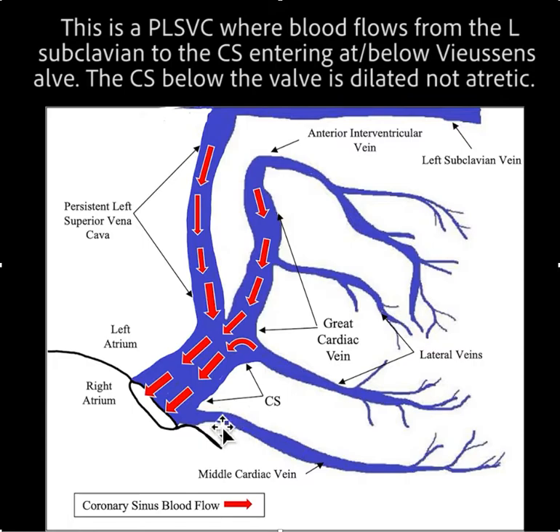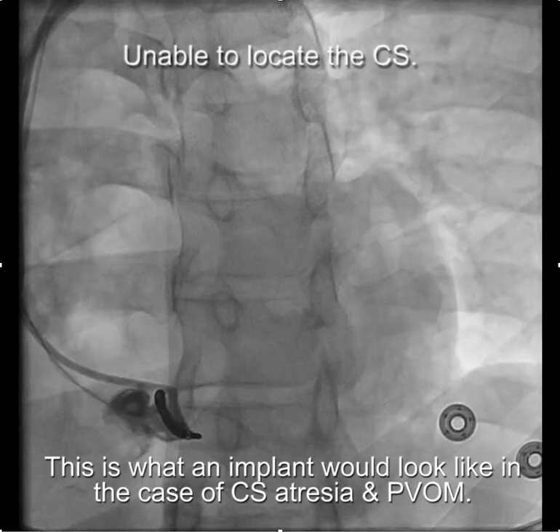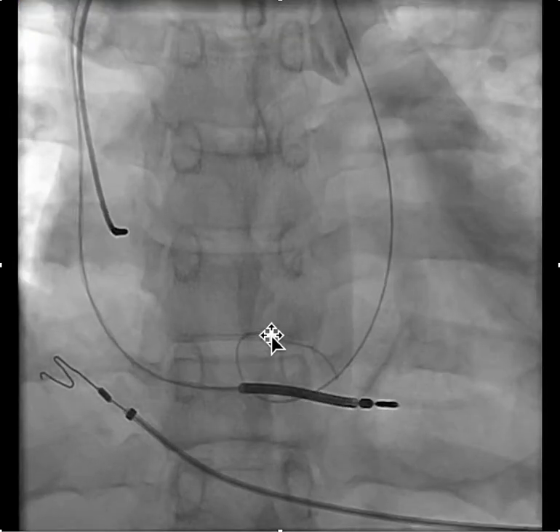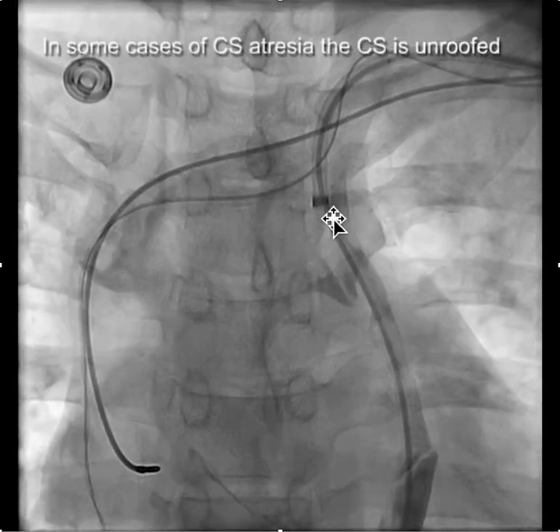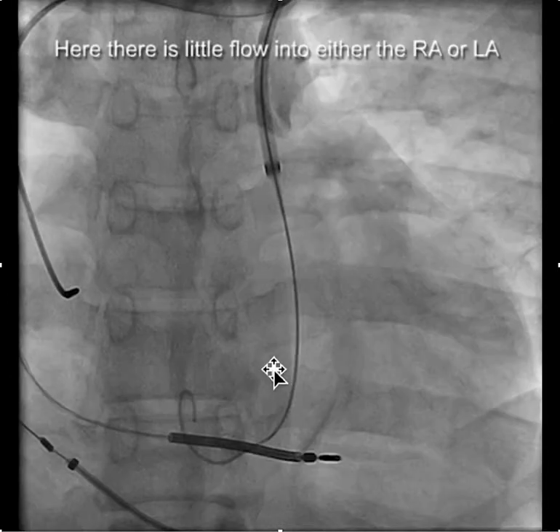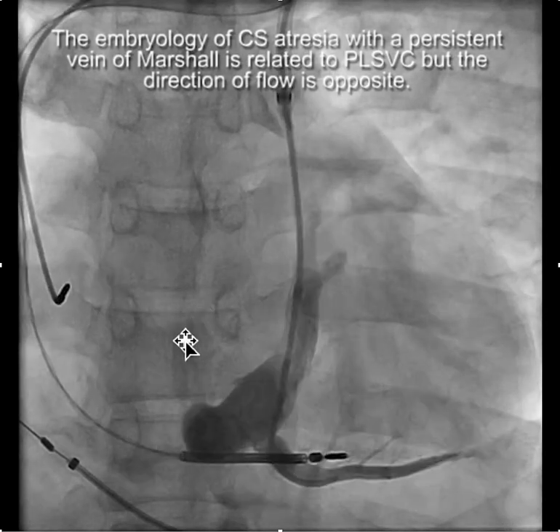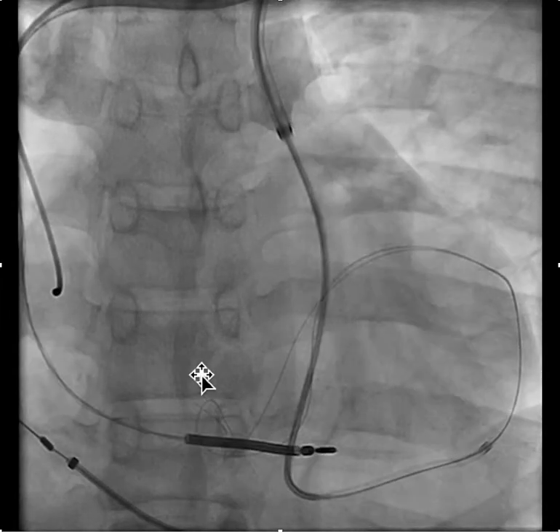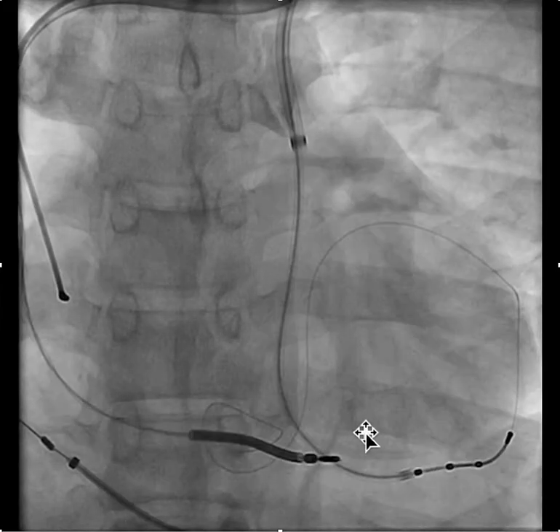Technically, this part is called the great cardiac vein. In our implant case, we were unable to locate the coronary sinus using the anatomic approach and contrast. Recognizing that such a thing exists, we looked at the clavicular-sternal junction, found the patent vein of Marshall, and determined that the majority of blood flow returned to the left subclavian with very little — if any — to the left atrium or right atrium. So we felt it was safe to implant down this patent vein of Marshall and place the LV lead as illustrated here.